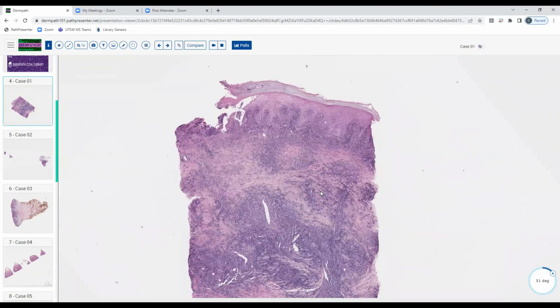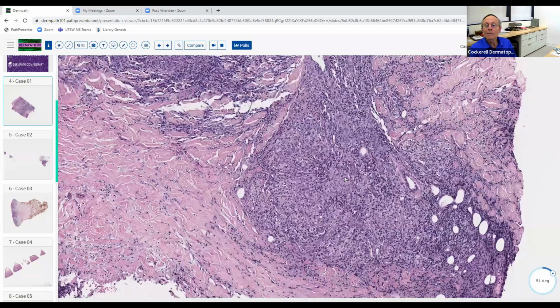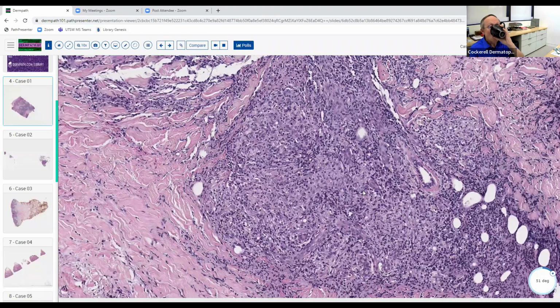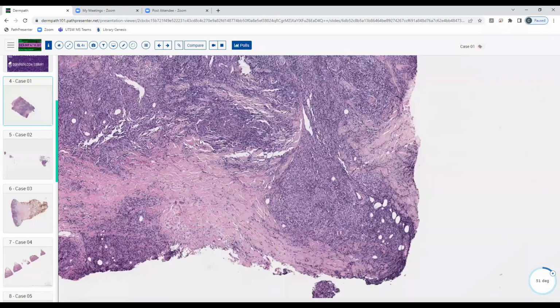Well, I was thinking something infectious. Well, infectious is one cause of that, but when we see areas where histiocytes predominate, what kind of inflammation do we call that? I am forgetting. You probably know, you're just not saying it. Oh, granulomatous? Yeah, granulomatous inflammation. And there's several different patterns of granulomatous inflammation. Do you remember the 5 patterns of granulomatous inflammation off the top of your head? I don't. Anybody want to help her out?